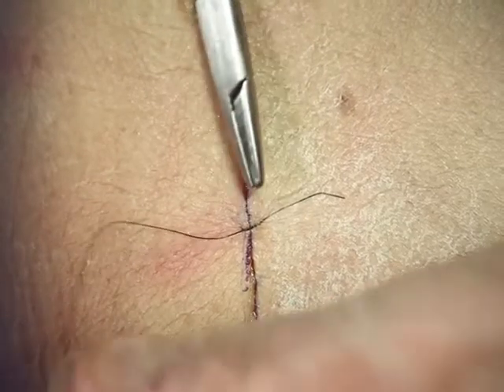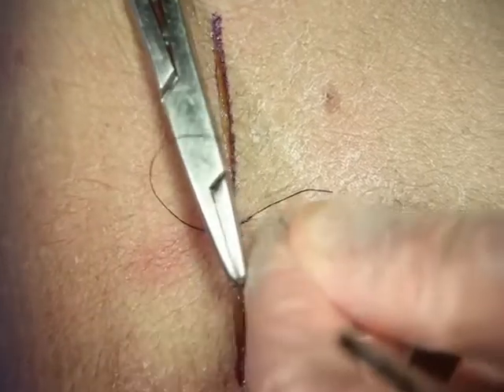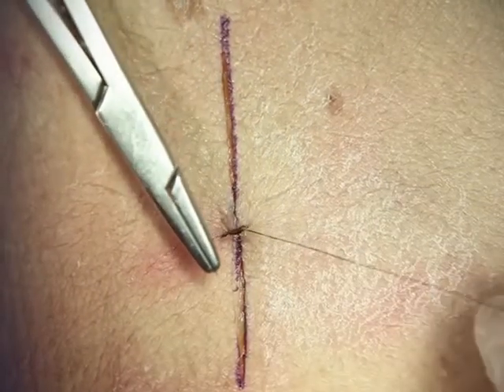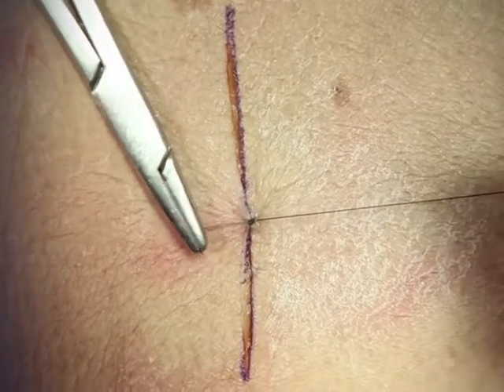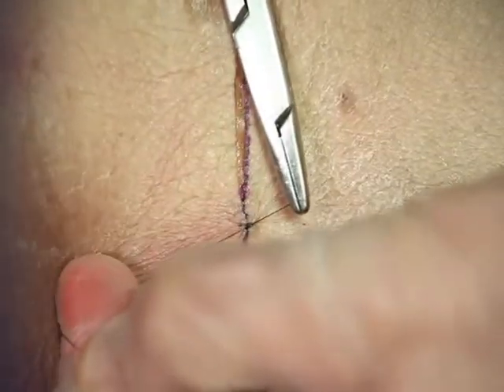Now because it's a surgeon's knot, it'll sit unless you pull up on it. So don't pull up on it — place the needle driver between the two, the short end and the loop end. Now you're going to loop it around only once. Grab the short end and then bring it to the opposite side, again squaring the knot. Don't pull up on the suture until you just get it down, and then you can tighten it. And now it's locked in place.